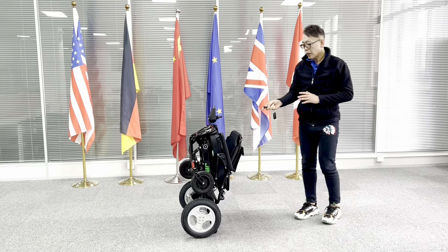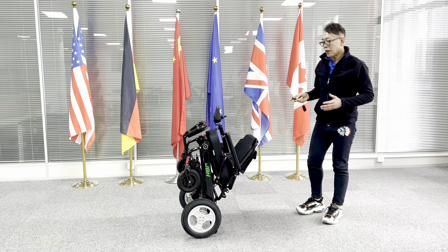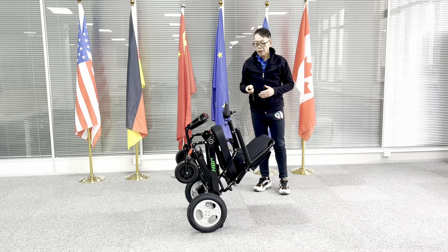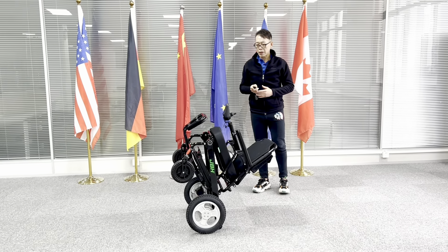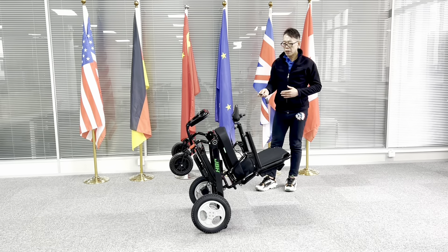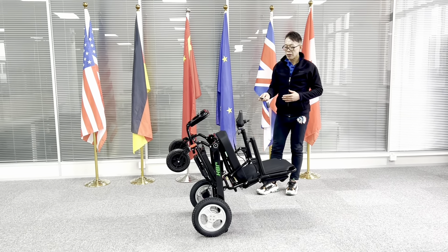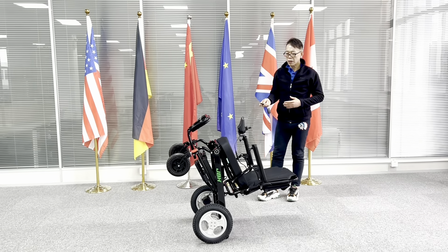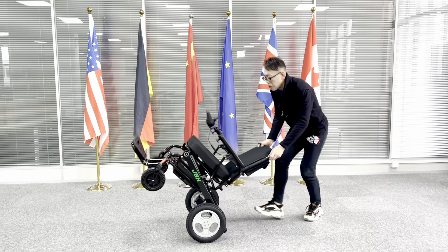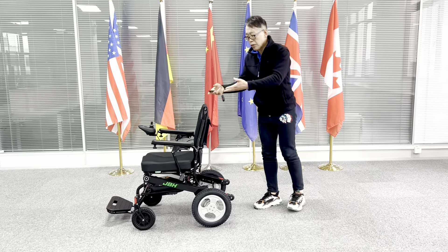Simply just one touch of the remote control, you can open the wheelchair. It's really convenient, not any effort required. You can fold this way or you can just have the wheelchair sit on the floor and then you can do remote control.